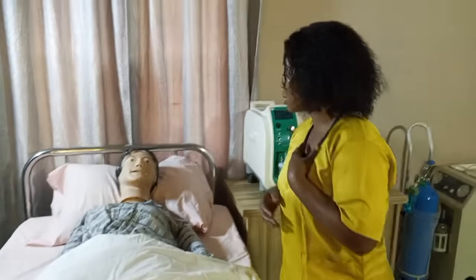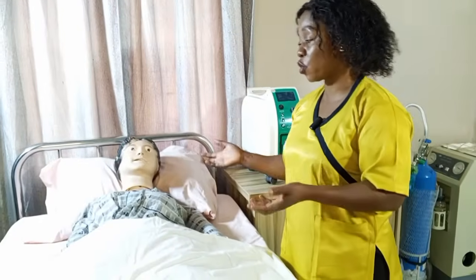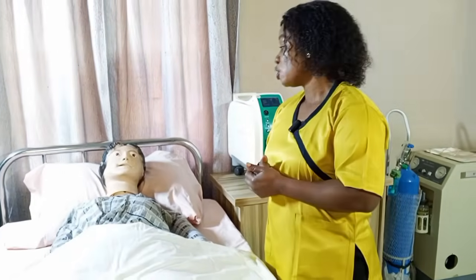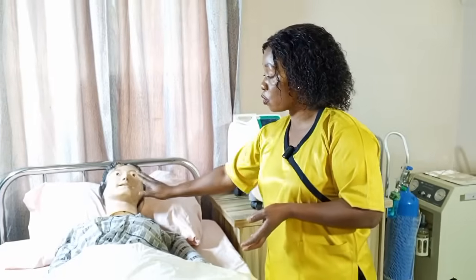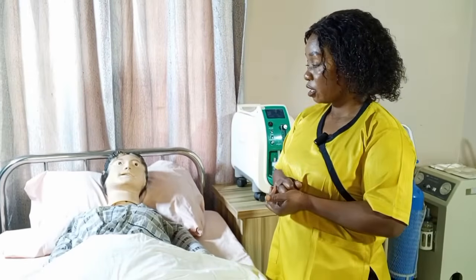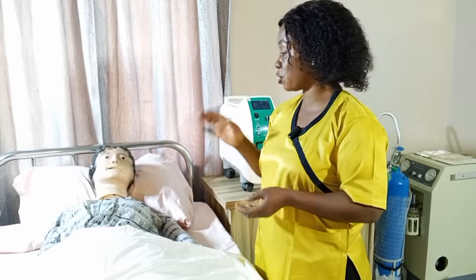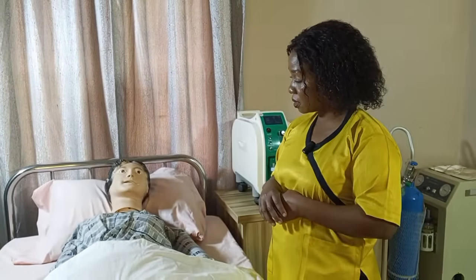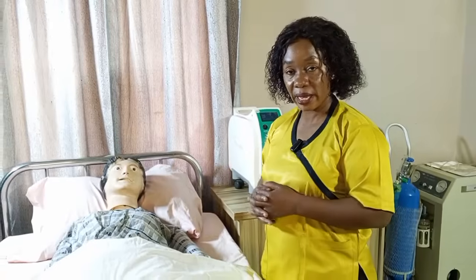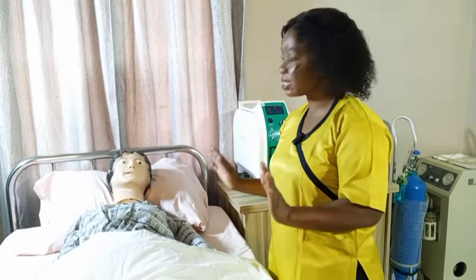Good morning, my name is Nurse Clements and I am here to administer oxygen to you because of your condition. I am going to use a tubing with face mask and put it on your face to administer the oxygen. I noticed that your oxygen saturation has dropped. Can you please tell me your full name and date of birth? The patient's name is Chukwemeka Ezee, date of birth first 1999. I have identified this is the right patient.